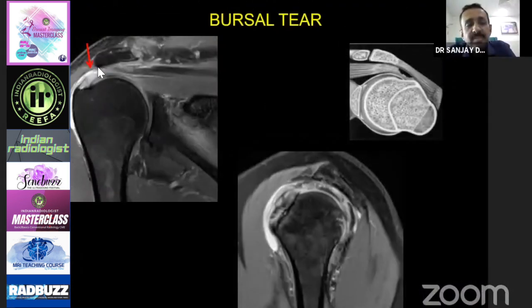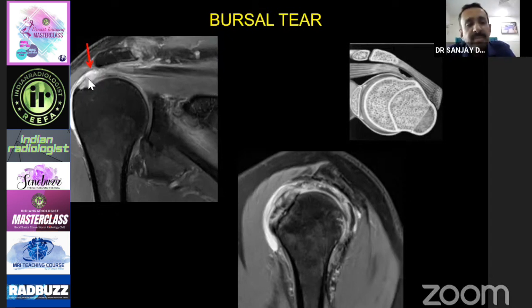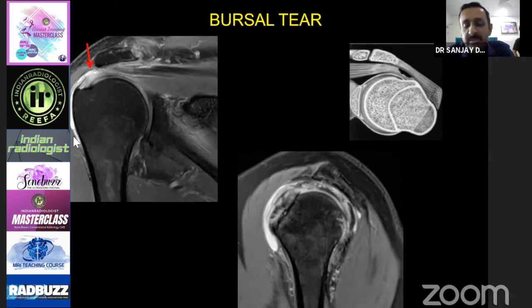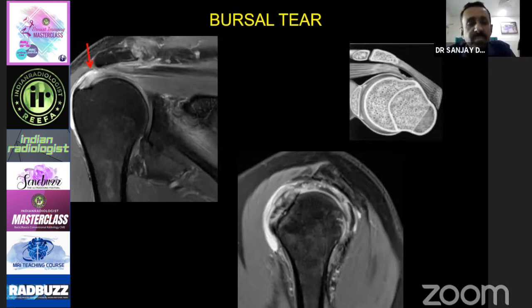This is an example of a bursal surface tear. The articular surface is intact — this black line is your supraspinatus tendon articular surface and insertion — but there is discontinuity of the bursal surface. Whenever there is a bursal surface tear, there is what is called a puddle sign — fluid collection along the lateral aspect of the greater tuberosity. This occurs because there is rupture of the wall of the subacromial deltoid bursa and fluid leaks into that space. If you identify this fluid, you can confidently diagnose a bursal surface tear.